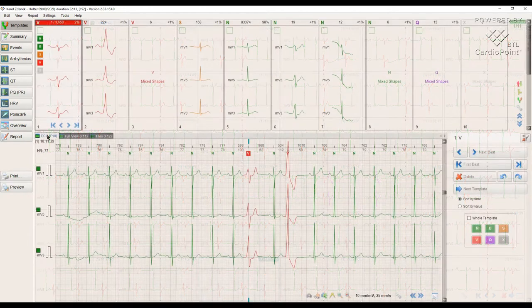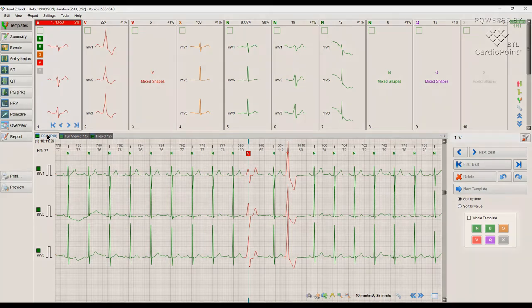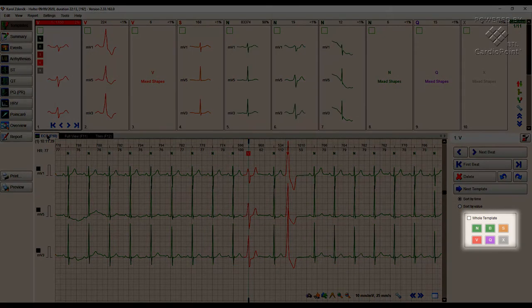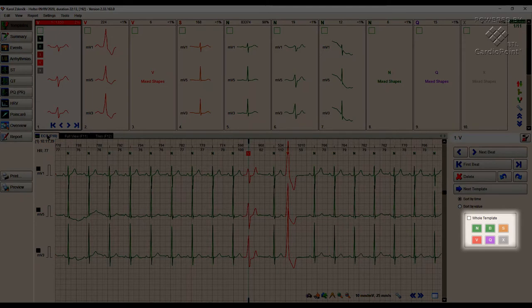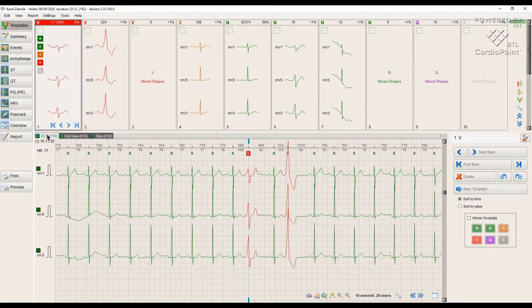In order to change the classification of a specific complex, we can use the corresponding buttons on the navigation panel, icons in the template itself, which change the whole template's classification at once, or the corresponding letters on the keyboard.